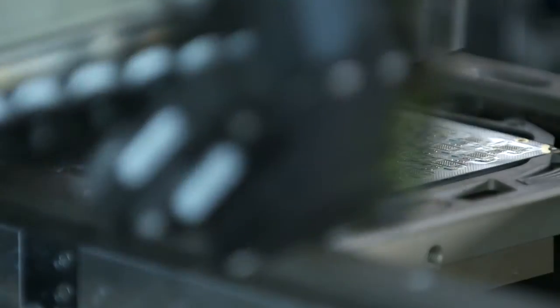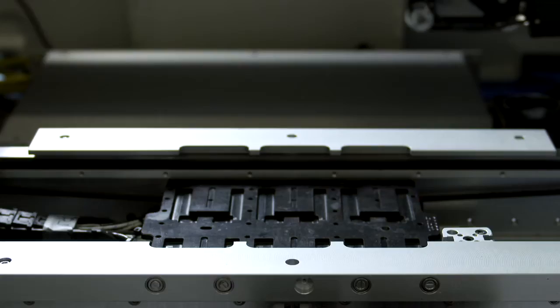When I first designed the device, our manufacturing department said that it couldn't be built.